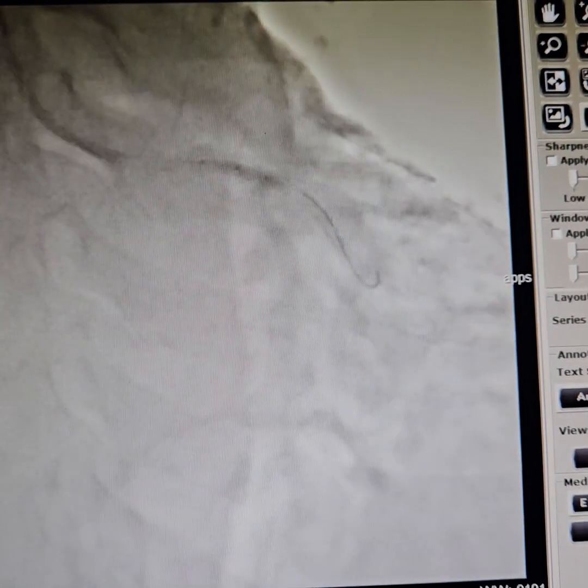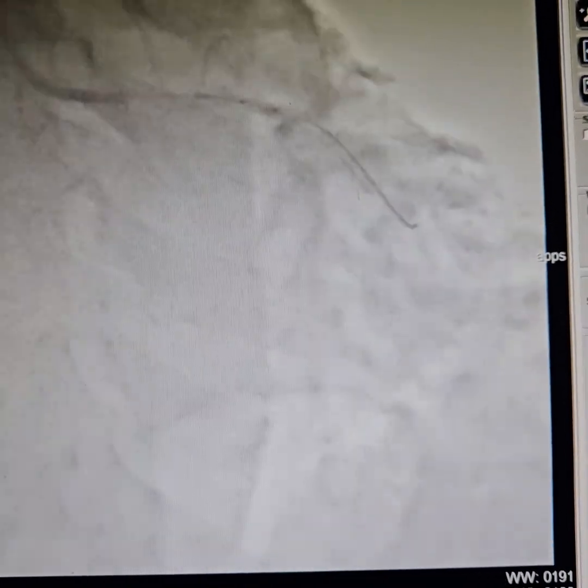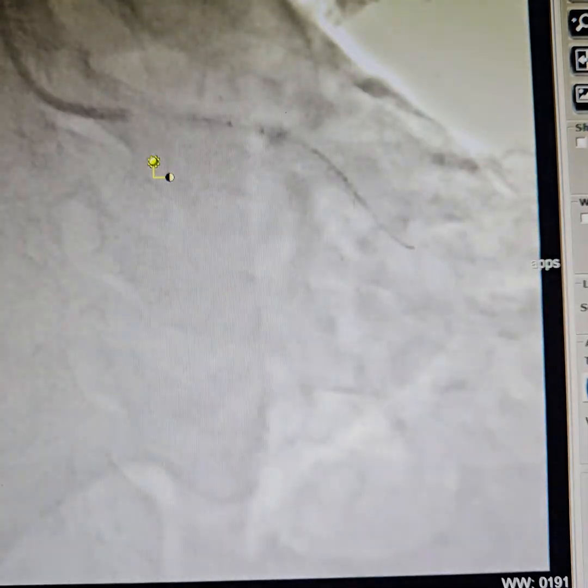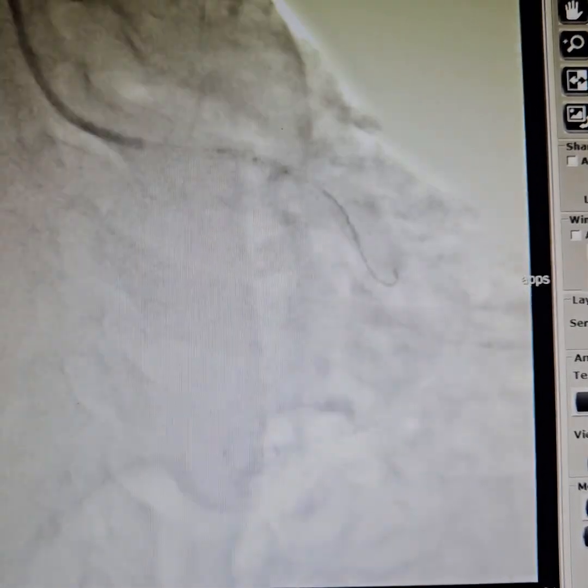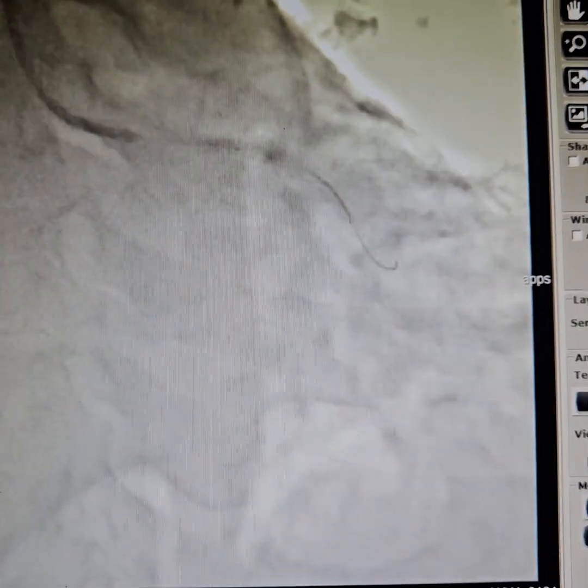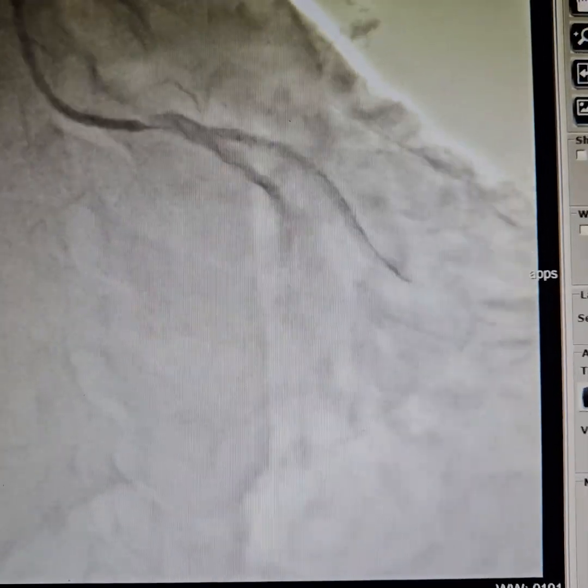After that we are post-dilating. Post-dilation is very important — you can achieve a very good vessel size. Next we'll show you the final view after adequate post-dilation.